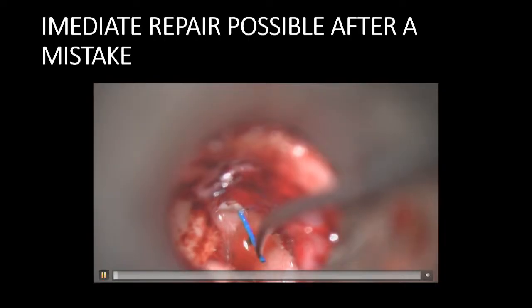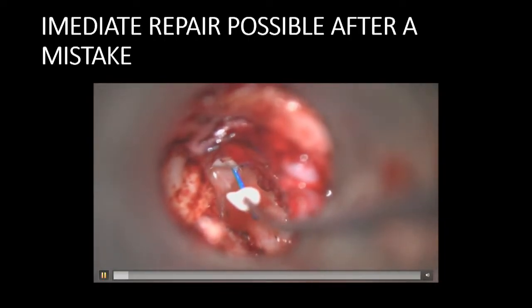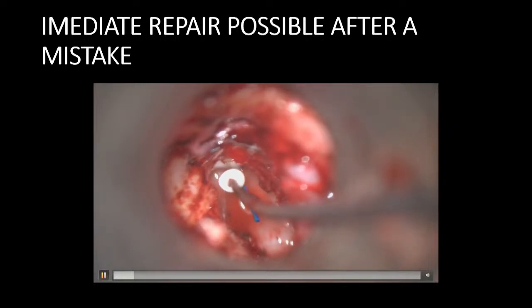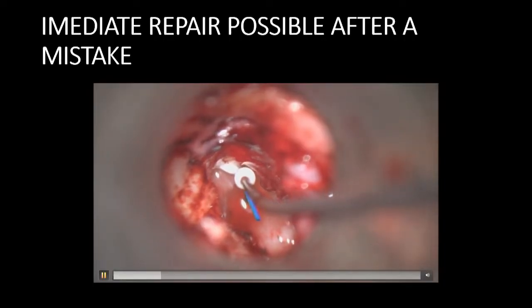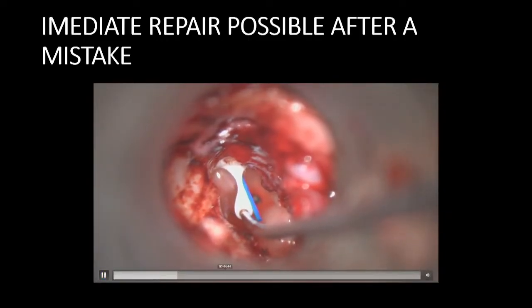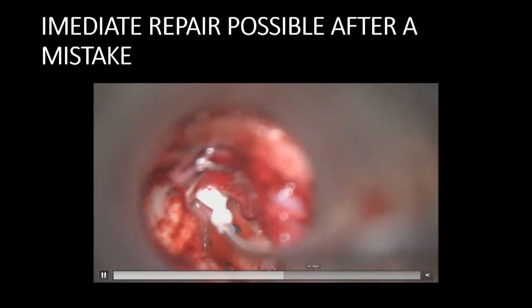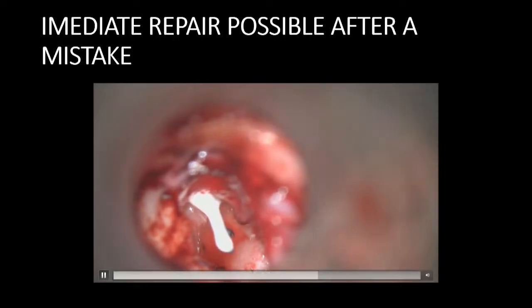Something that we've started doing, when you've got a fixed footplate and you're sitting with an eroded incus, is we actually build up and make a new incus by putting a little bit of cement on the body of the incus, putting our nylon to where we would think the incus probably should lie. We can position it wherever nicely over the stapes, and then we slowly build it up, and this takes a little while. Problem now is that I built this up nicely, and in this case, I now need to drill the stapedotomy. Sorry, just for sake of time, we're going to move on.